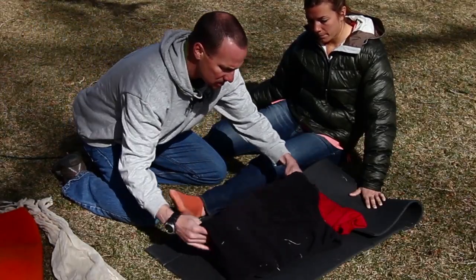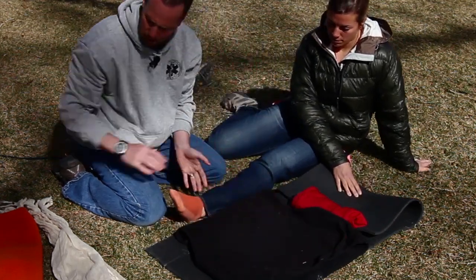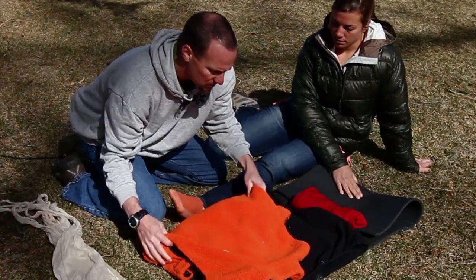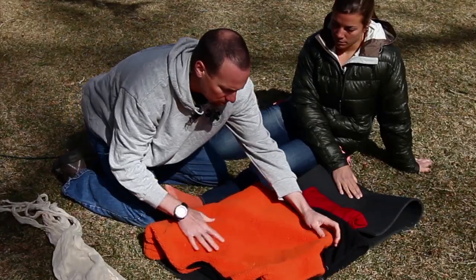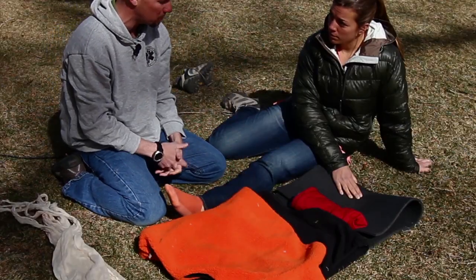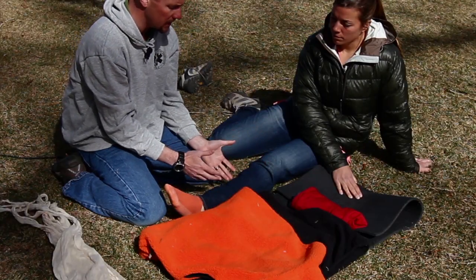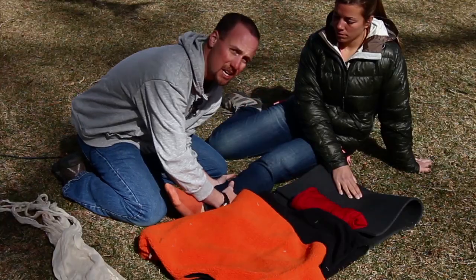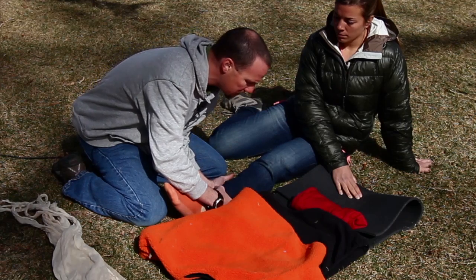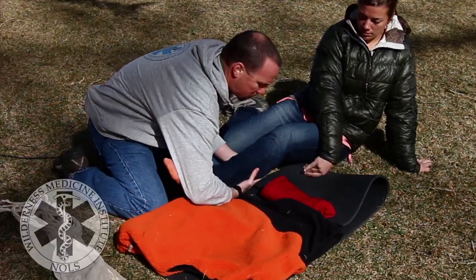I'm going to think about some padding in places where there are going to be curves. This padding will come underneath Jordan's knee so that it does not lock her knee in a straight position. I've got padding coming down around her lower leg to come around the curves of her calf and her ankle. I'd like this padding to be flat and not wrinkled to minimize any hot spots or uneven pressure. To move all of my material underneath Jordan's leg, I need to be very deliberate about supporting the injury site, perhaps grabbing some extra help to slide our padding underneath.